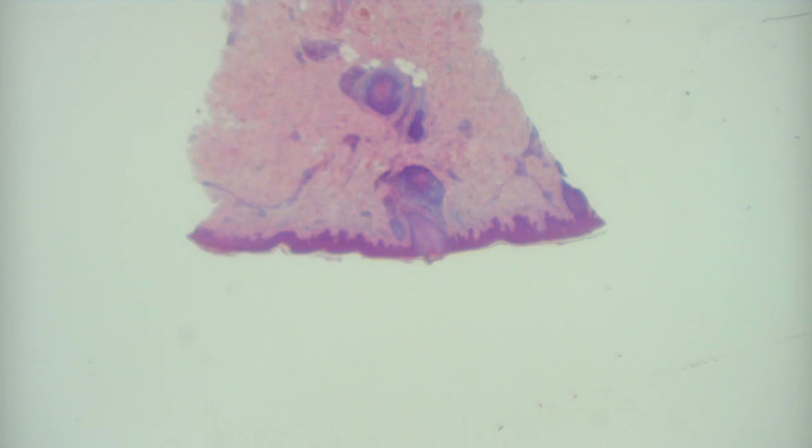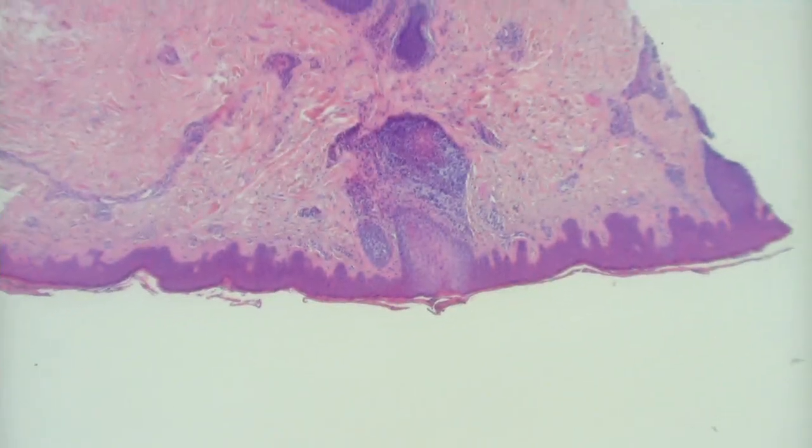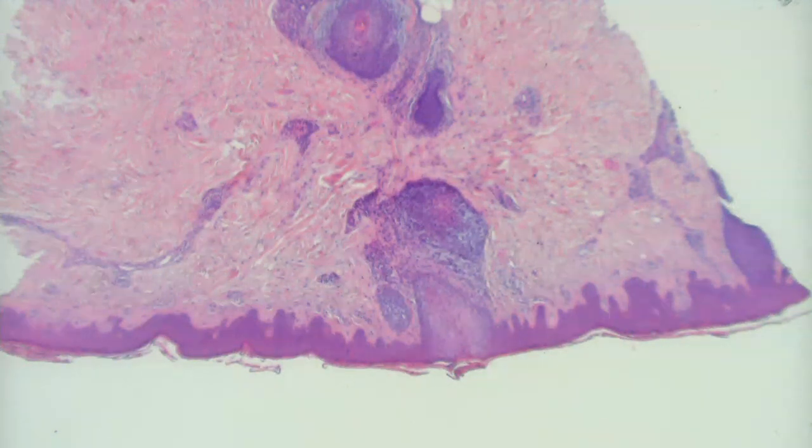Okay, who wants to give this one a go? So this is a punch biopsy. The process is primarily in the dermis, and there was an inflammatory infiltrate. I noted that there was a lot around the vessels, and then I think there was some interface too. I'm not seeing it right now. And the other things that I noted were some mucin in between the strands of collagen, and yes, there's not too much interface.